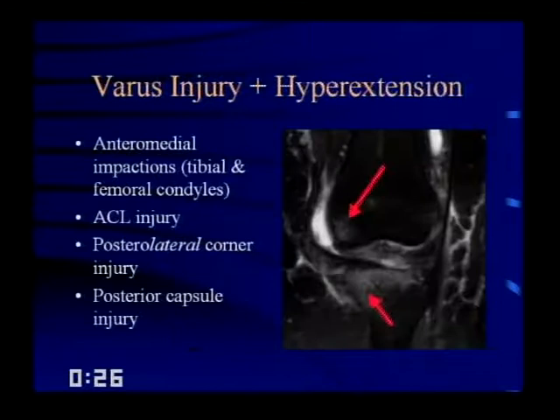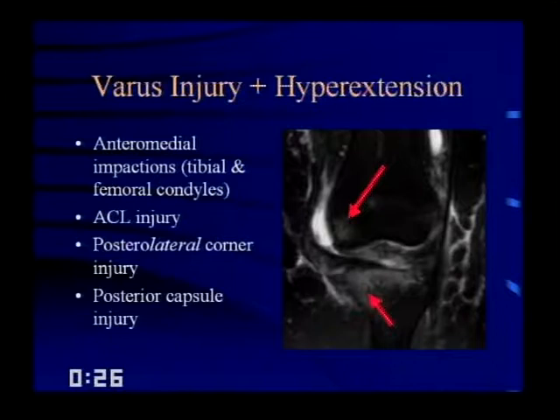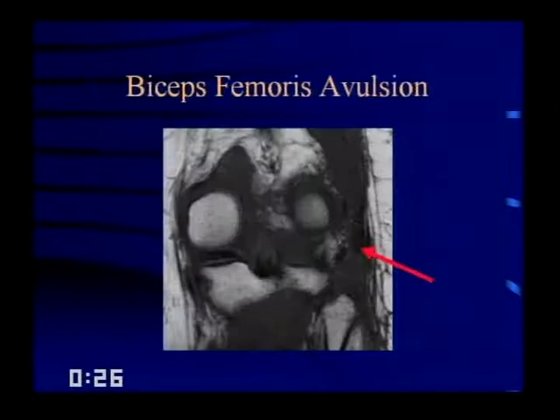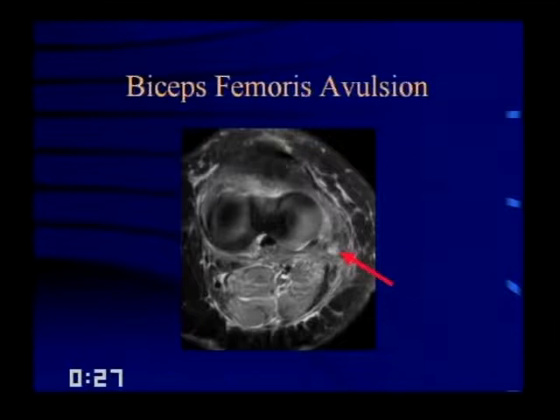Varus injury plus hyperextension is uncommon, but to reinforce the concept: the varus component gives medial impactions, and hyperextension gives anterior impactions — combined, you get anteromedial impactions of the tibial and femoral condyles. Therefore look for posterolateral soft tissue injury. These patients can also get ACL and posterior capsule injury. Here you see the anteromedial bone bruises, and this person had a biceps femoris rupture — the tendon doesn't reach the fibula, with a lot of edema around it. On T2 axial images, there's a big hole where the biceps femoris tendons should be.